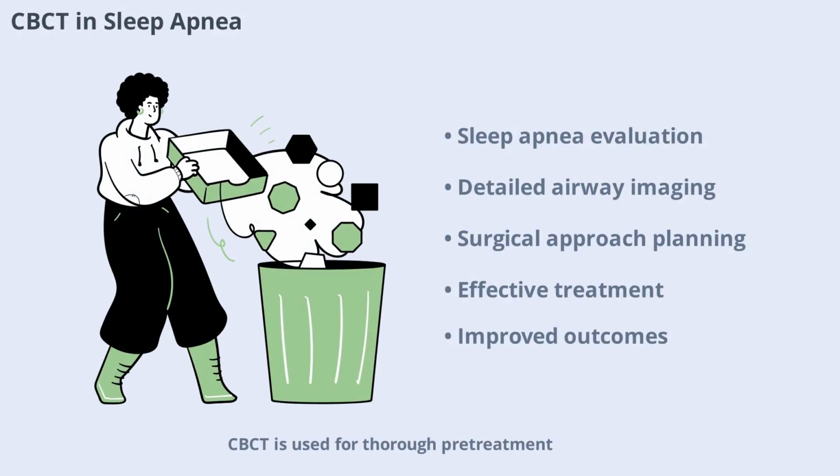CBCT is used for thorough pre-treatment evaluations of patients with obstructive sleep apnea. It helps determine the appropriate surgical approach by providing detailed images of the airway and surrounding structures. This information is crucial for planning effective treatment and improving patient outcomes.